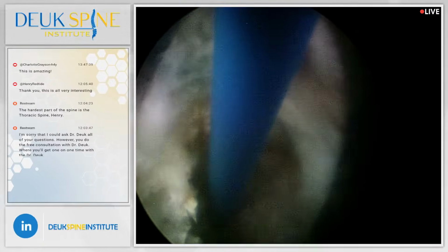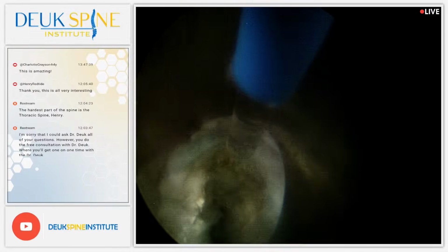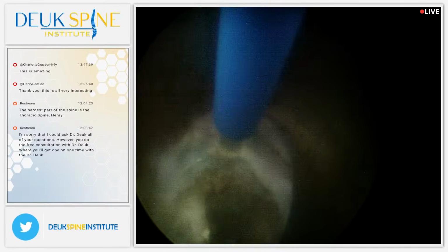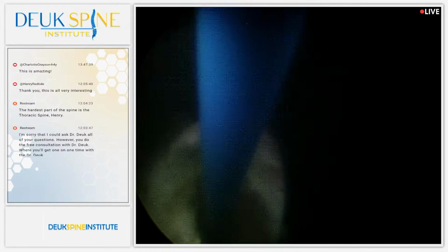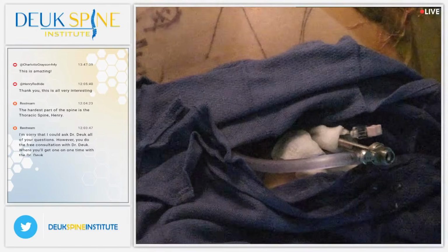Now that laser fiber is 1 millimeter in diameter. So 1 millimeter, that's the glass part right there. The plastic over the glass adds additional width to it. But the actual laser fiber is only 1 millimeter. And that transmits energy from a laser machine that we have here in this operating room. You can't see it, but it's down by the patient's feet. It's the size of a large suitcase. And that machine is over a $100,000 machine. Nowadays, the new ones sell for $200,000.